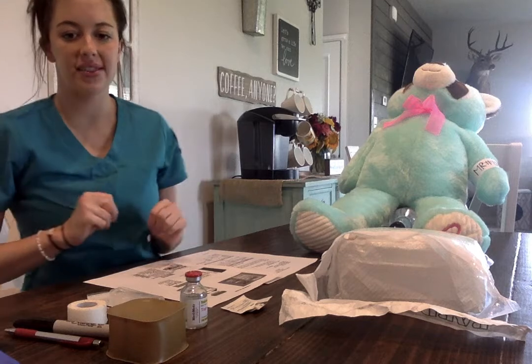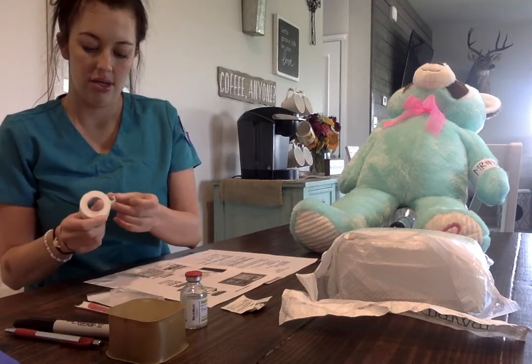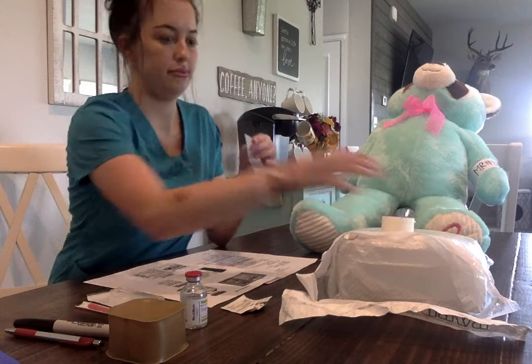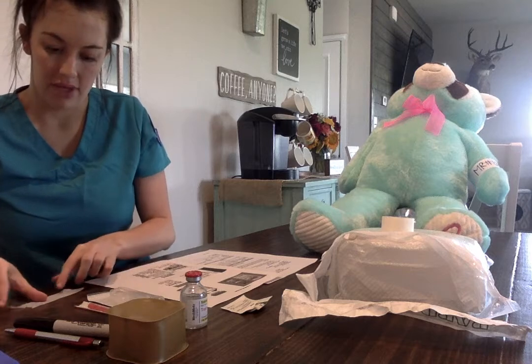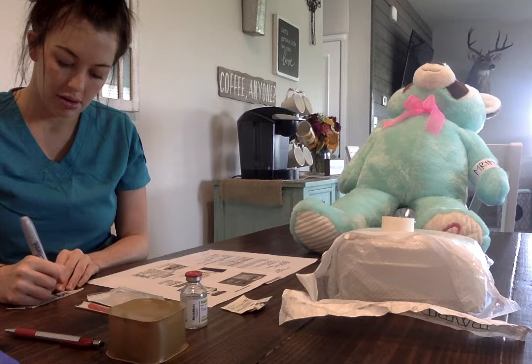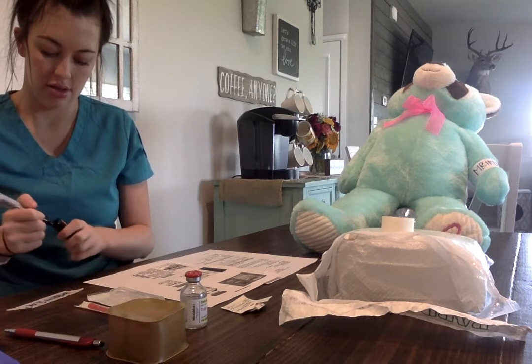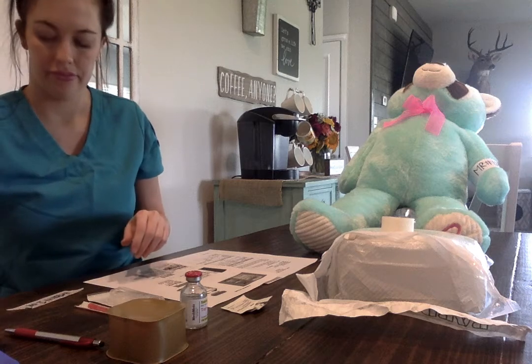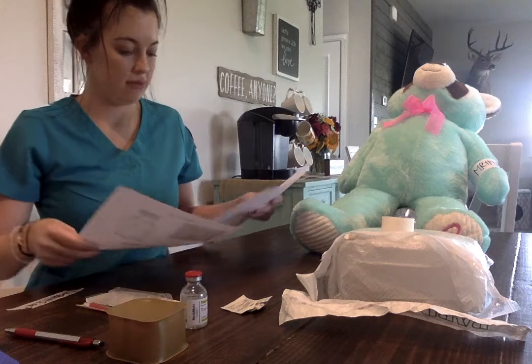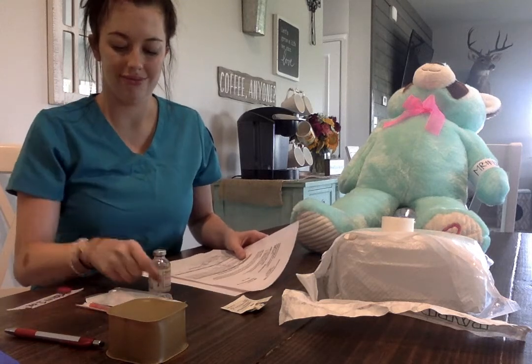Okay, so I'm going to go ahead and label the syringe. I'm labeling it heparin, 1 ml. Okay, so here's my bottle.